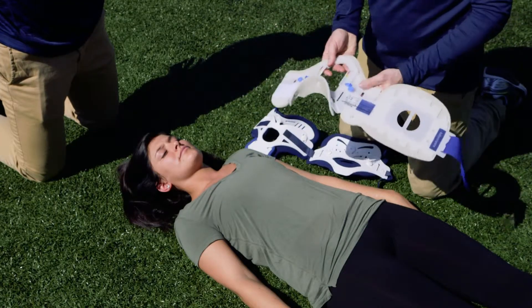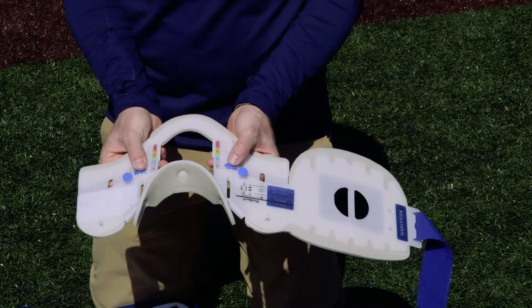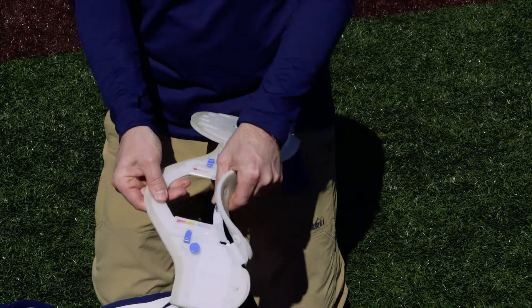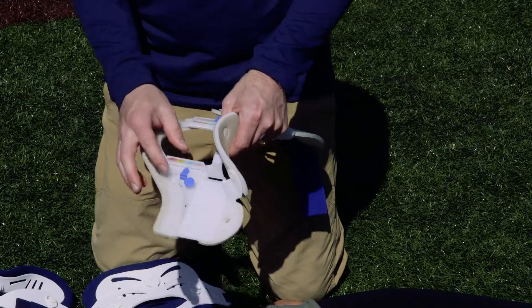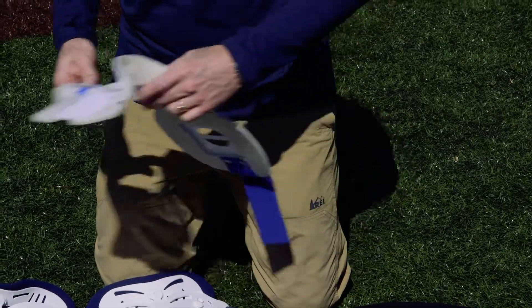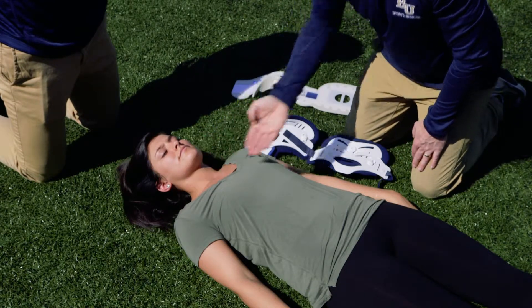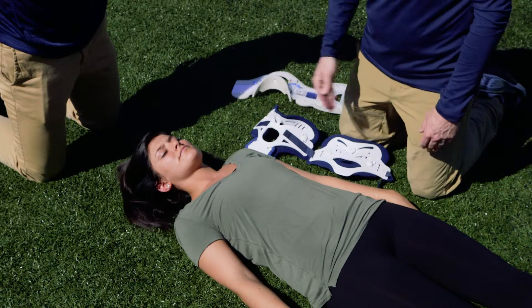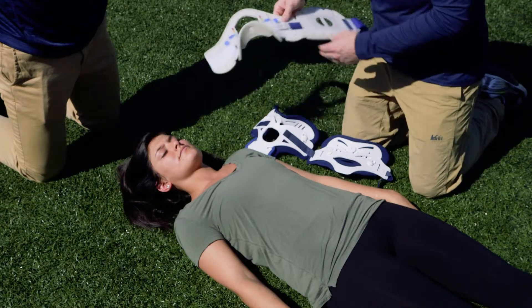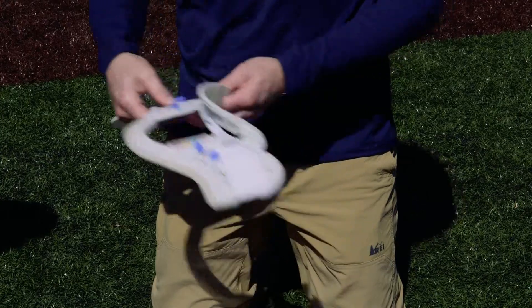This particular one has small tabs that pull out, and these little measurement clips move up and down, allowing it to slide up and down depending on the length of the athlete's neck. To size it, we take our hands and place them from the bottom of the jaw to the top of the shoulder, giving us a neck length of typically three to four fingers, and then we transpose that measurement directly onto the brace to get the appropriate size.